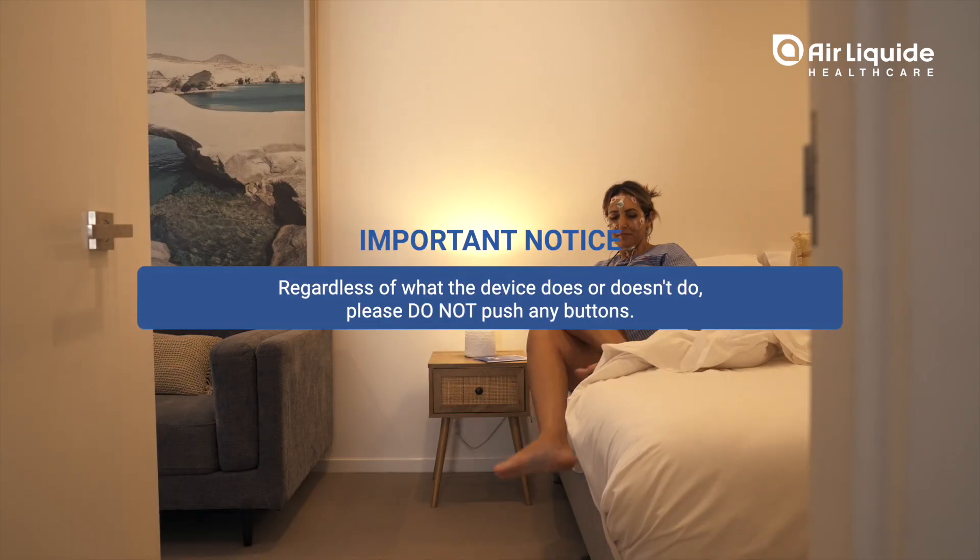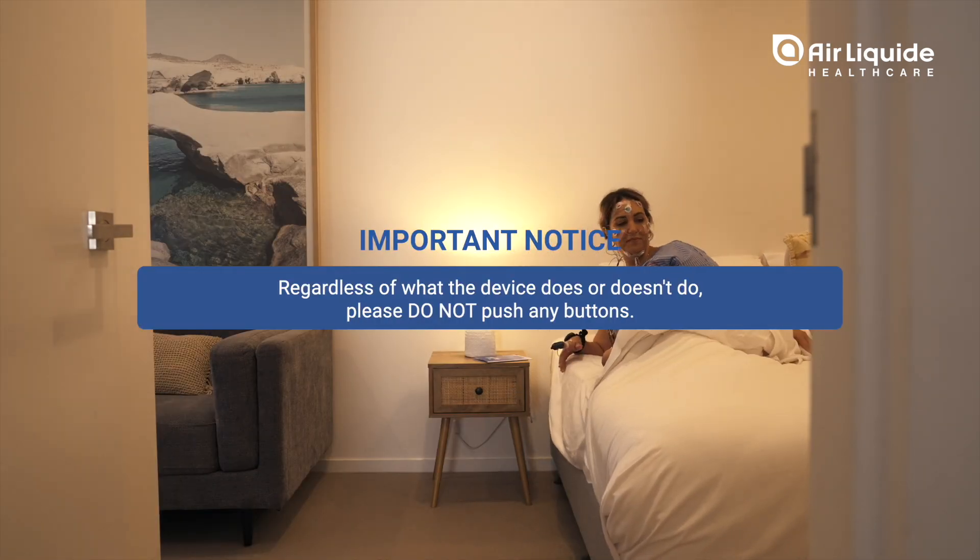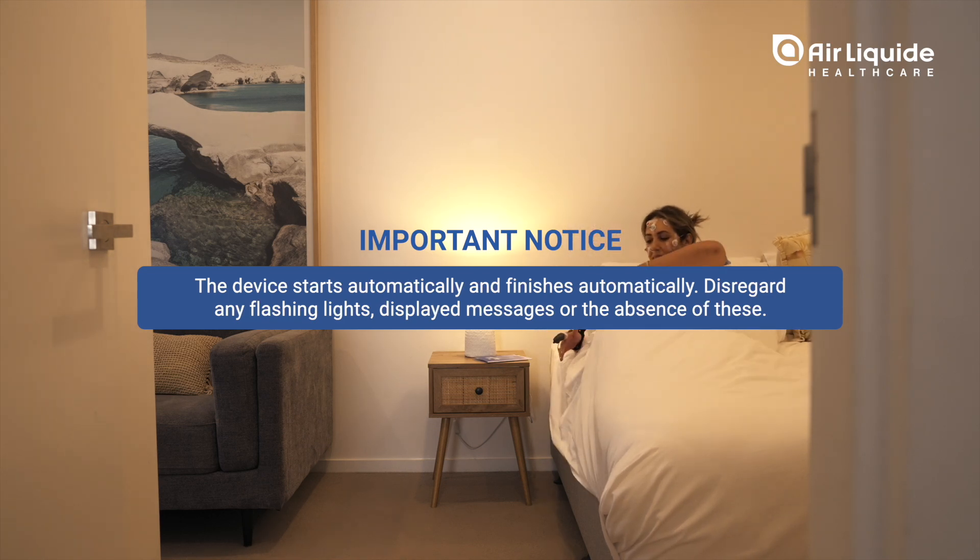The recording will start automatically. Regardless of what the device does or doesn't do, please do not push any buttons. The device starts automatically and finishes automatically. Disregard any flashing lights, displayed messages, or the absence of these.